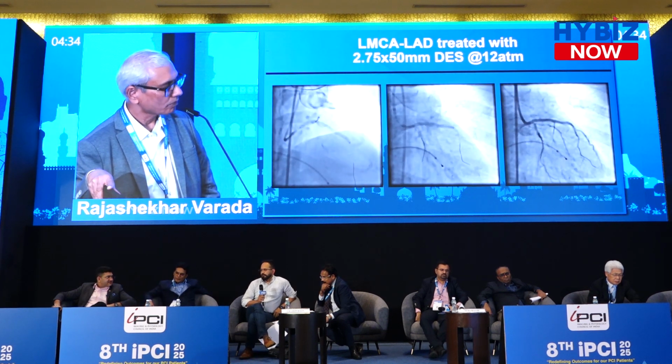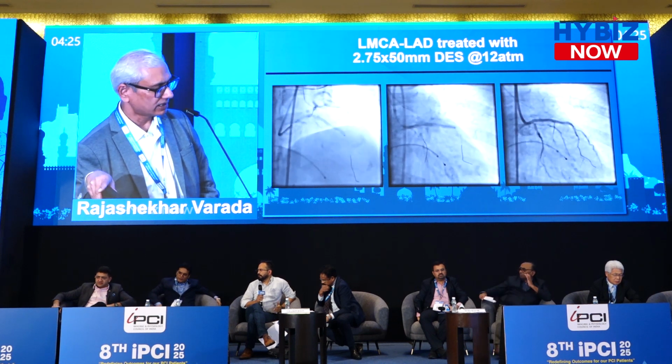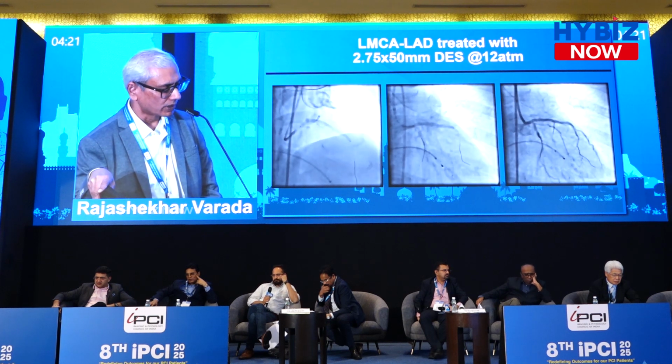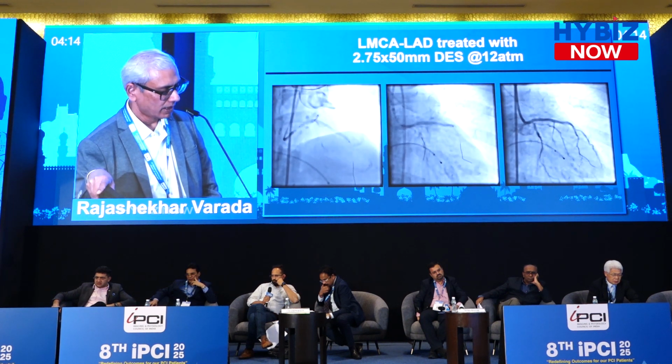If you are using imaging, and sizing one size down, particularly with a cutting balloon, you can go up to high pressure also. Yes, so you can go up to 18, 20 also. Especially the scoring balloon is a non-compliant balloon. So it also helps us modify the lesion much better.